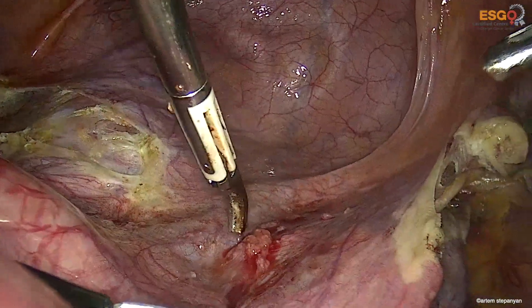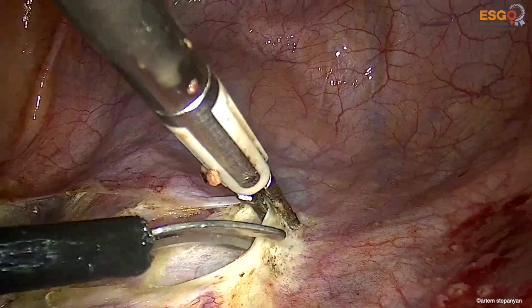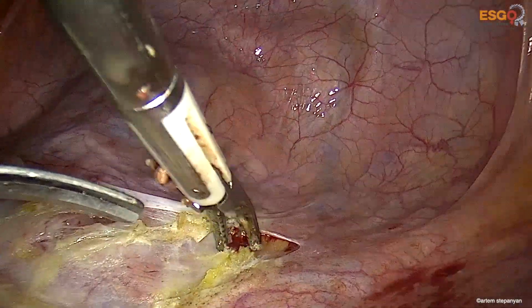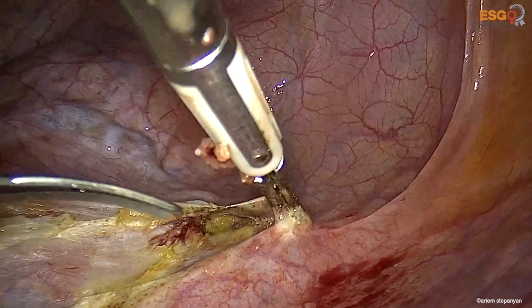Here we notice that there is another tumoral implant on the anterior leaf of the broad ligament, which is being excised together with the pelvic peritoneum in one block.